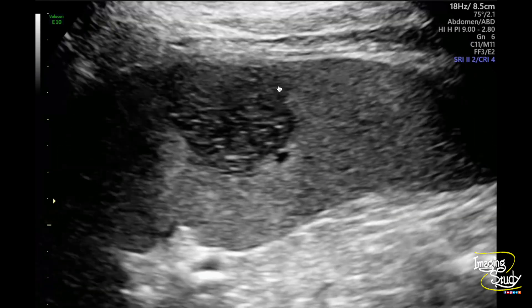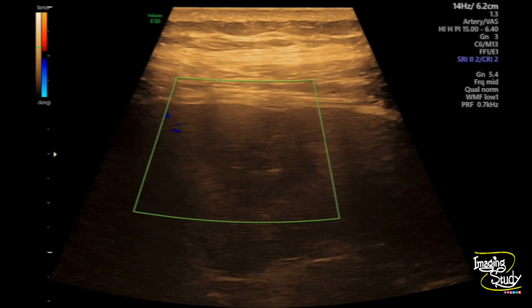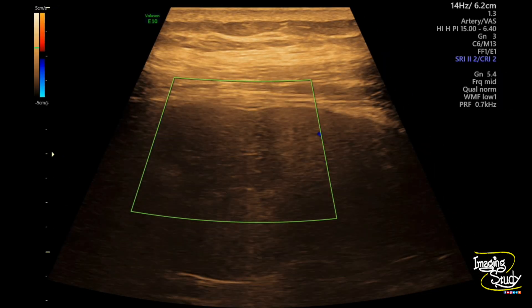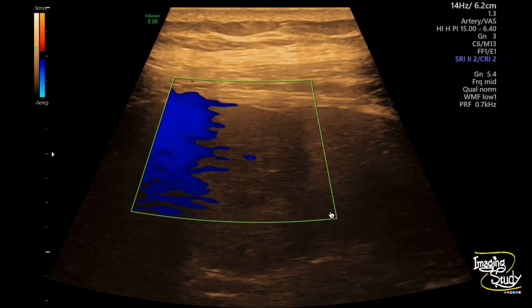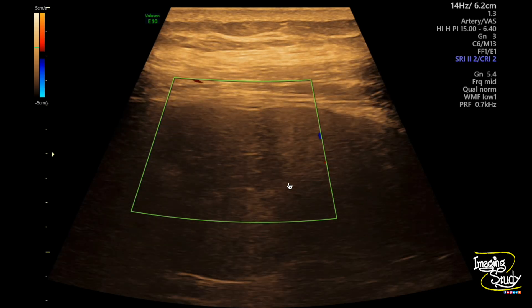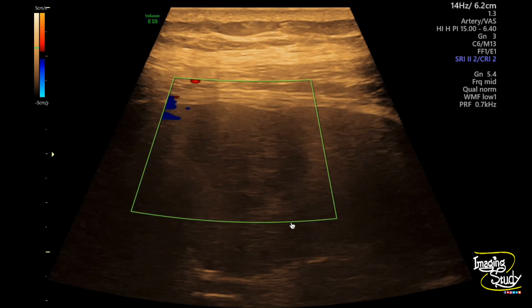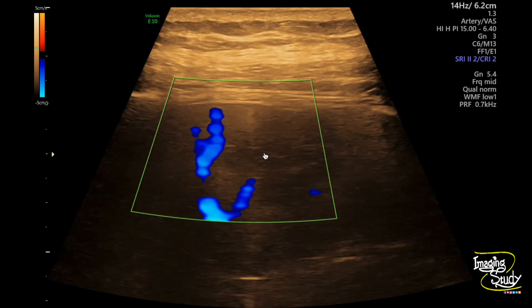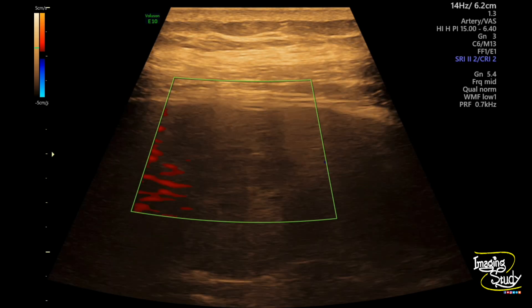On color Doppler you can see there is peripheral vascularity — this type of lesion usually has a peripheral inflammatory reaction going on — but there is no internal vascularity within the lesion.